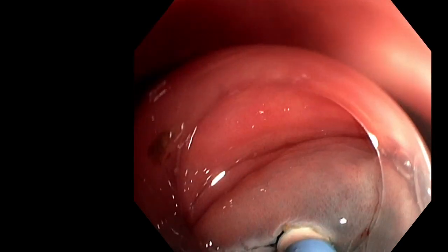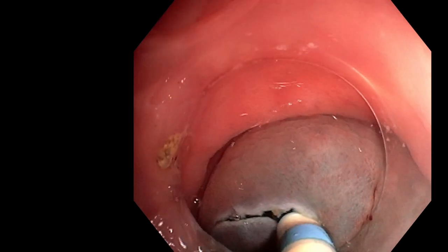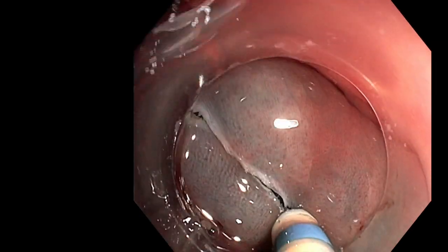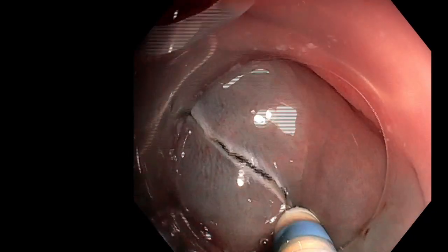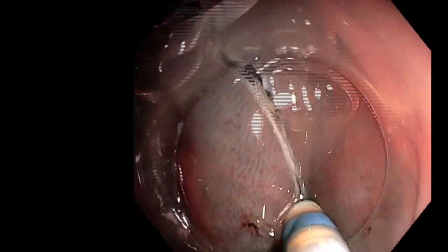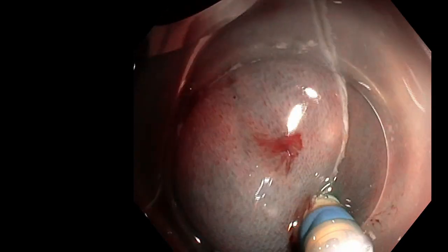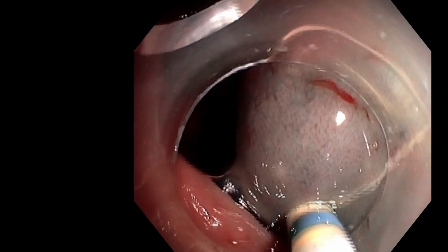If you are not sure of the position of the lesion, you should go back and check that your axis is okay. But if you know exactly where the lesion is and you are quite sure of your axis, you can follow your incision by doing it circumferentially. It is your strategy when you want to use traction. Do your circumferential incision first, slowly adapting yourself, doing small incisions, and the sum of these small straight incisions will make a round shape and will join the initial part of your incision.